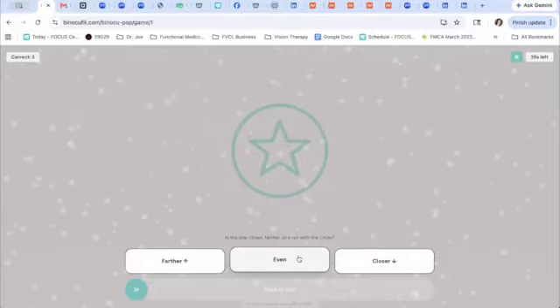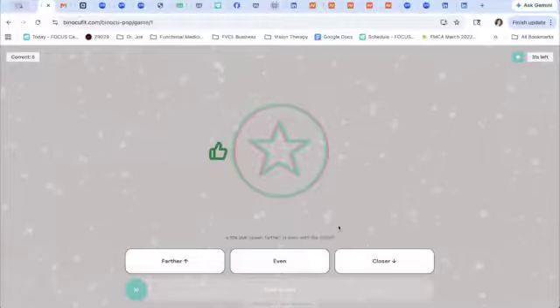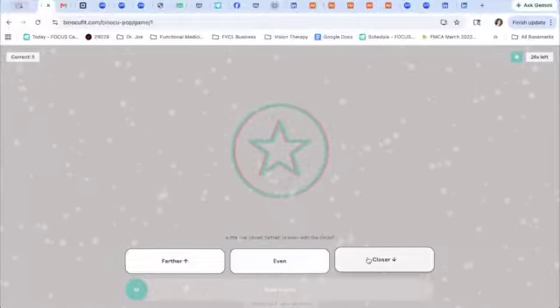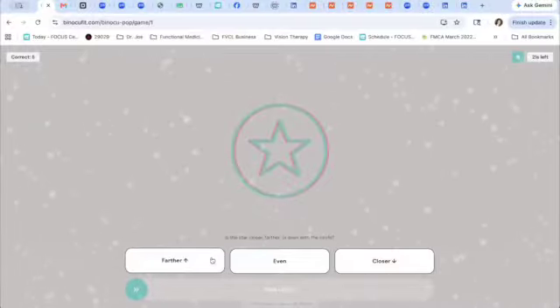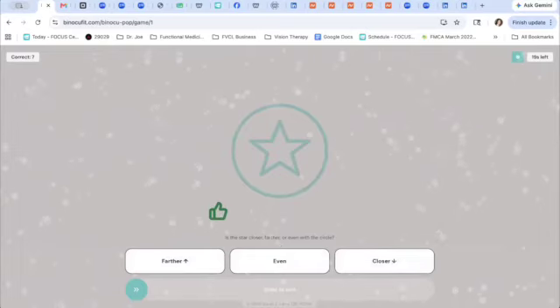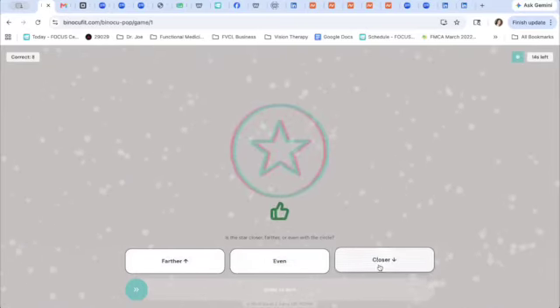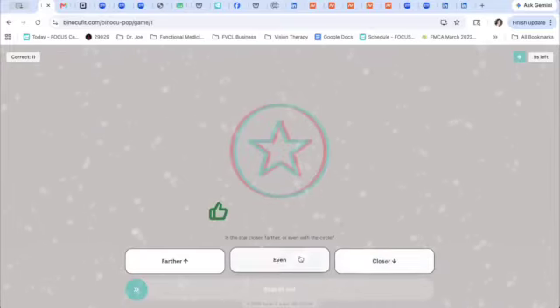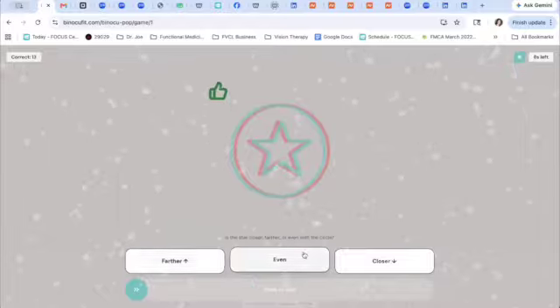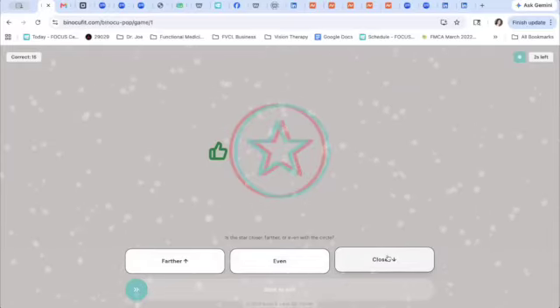This is not yet designed to push for a full range of binocular convergence or divergence. It's more about giving that sustained experience of can I make that decision of how my eyes are coordinated. The feedback that I've gotten from it is people feel it, right? You can feel when I see the pop and when I don't see the pop. So this is going through a little bit of a small jump duction, but you're consistently having to adjust and change that coordination of the eyes and make that decision.